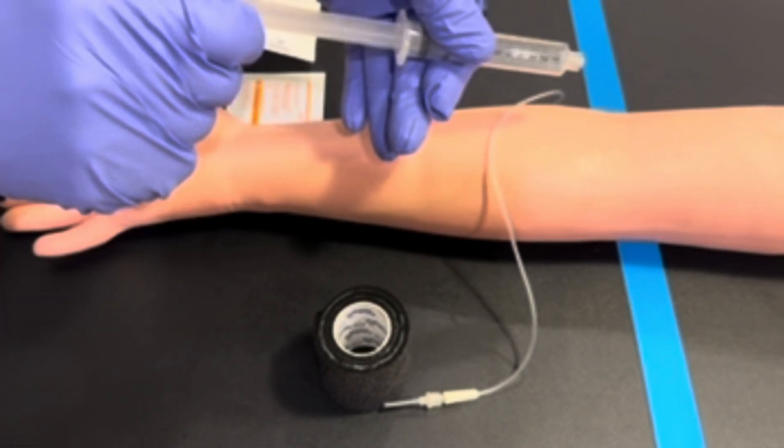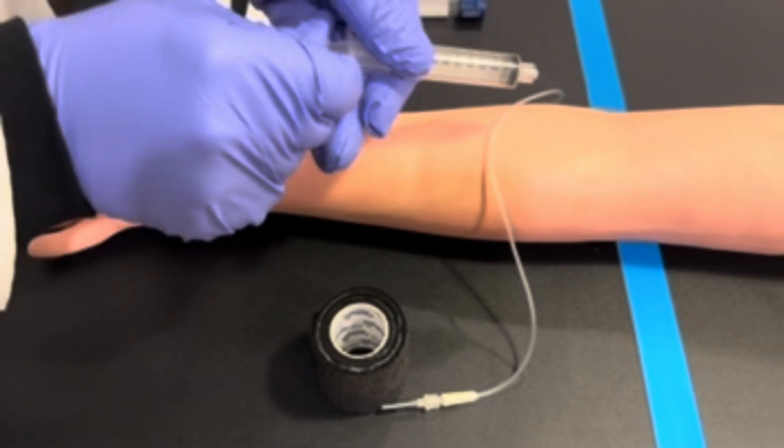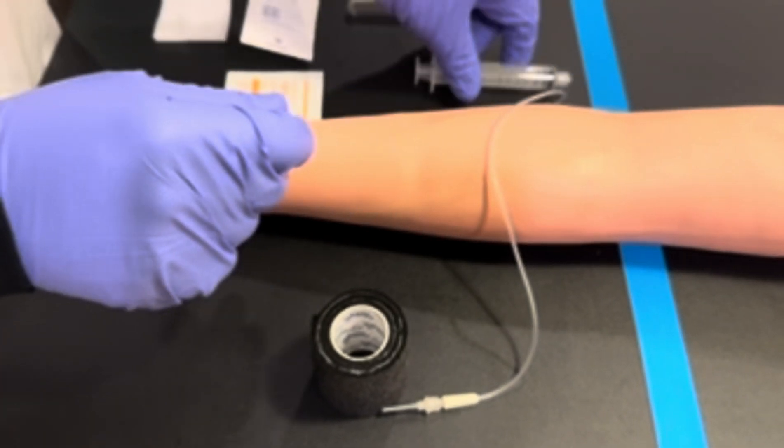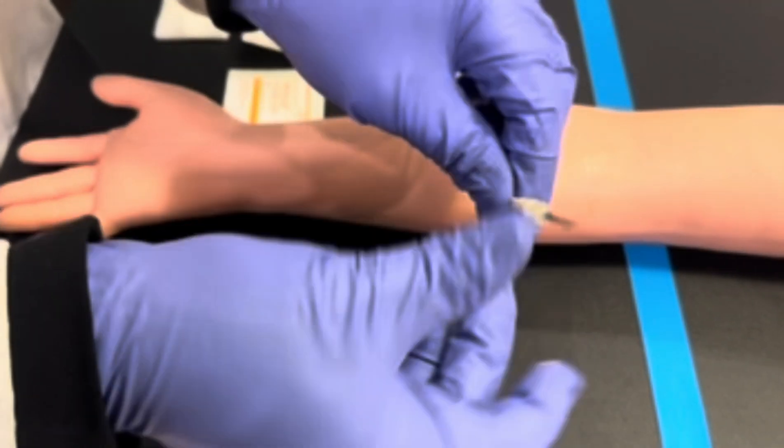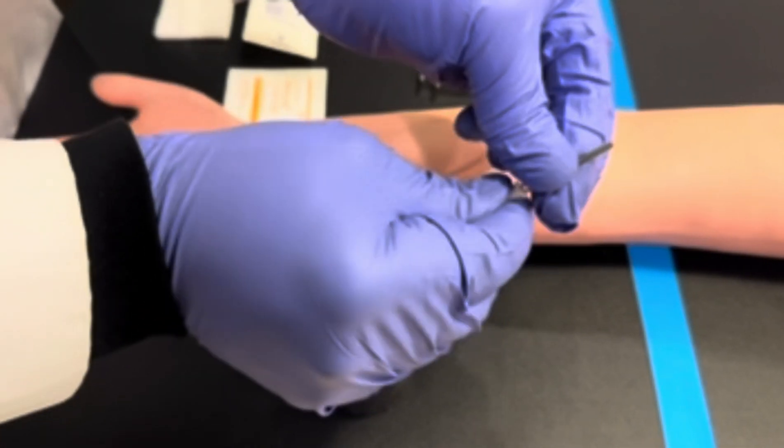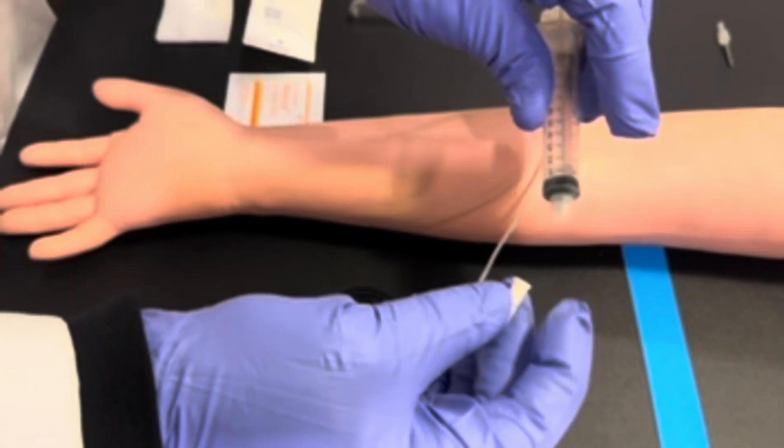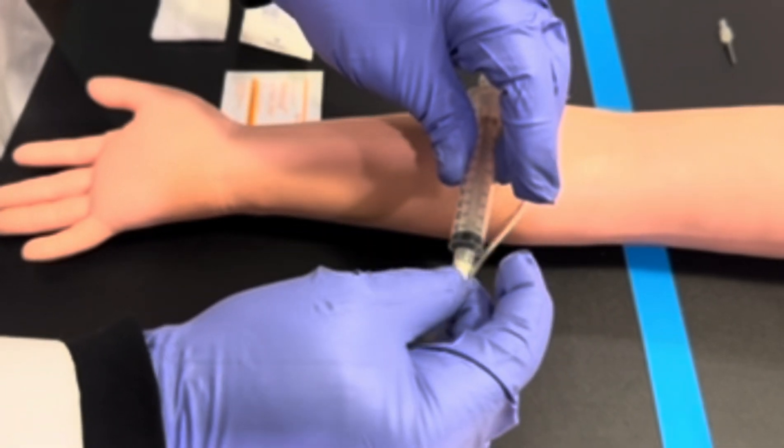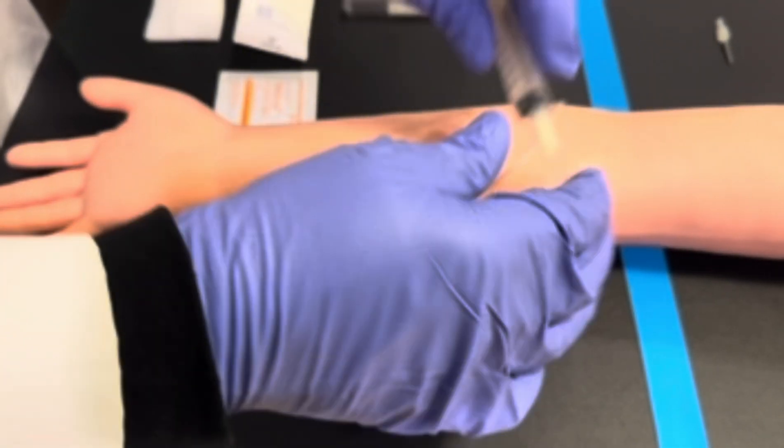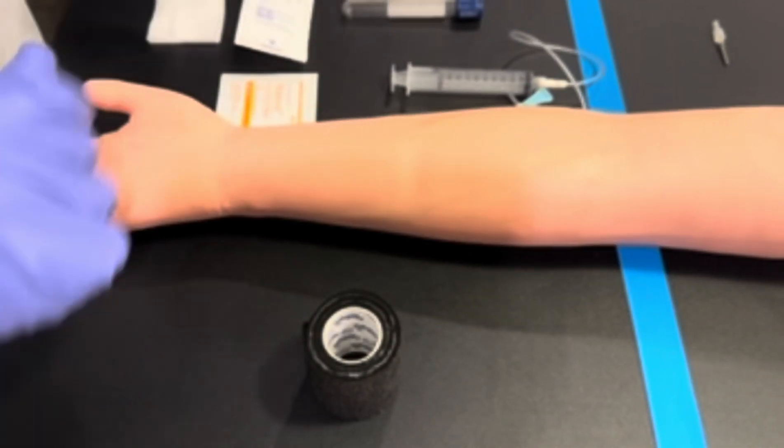First, we're going to take the plunger of the syringe and flush the air out of the syringe three times. Disconnect the secondary needle from the butterfly needle. Attach the butterfly needle to the hub of the syringe device.